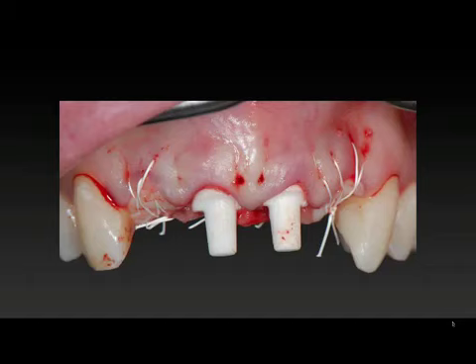We like to have more bulk of zirconia in our abutments. The lateral abutment is much thinner, and it could probably withstand the force of 4 teeth. But when we have an alternative to that, when we can do this on 2 heftier implants, why the risk? And this is our philosophy. Our philosophy is to try to minimize the risk wherever we can and give the patients the most aesthetic results possible. And because we're using a one-piece design, we're not scared to put 2 adjacent implants in.